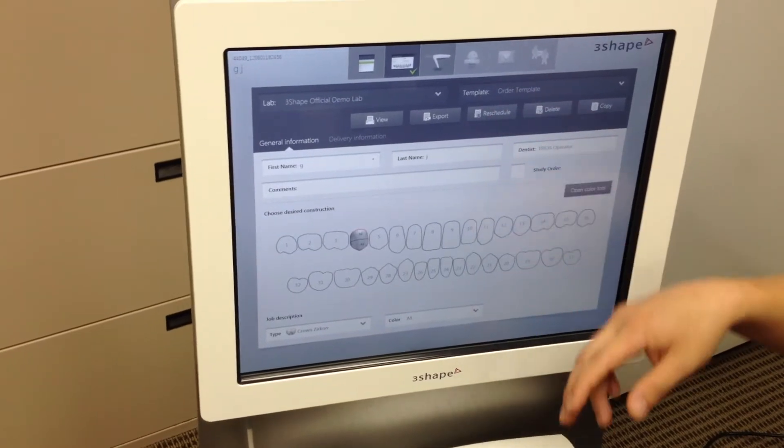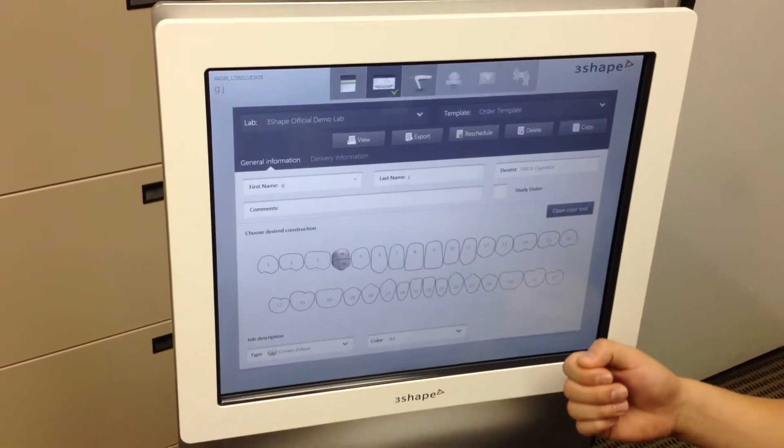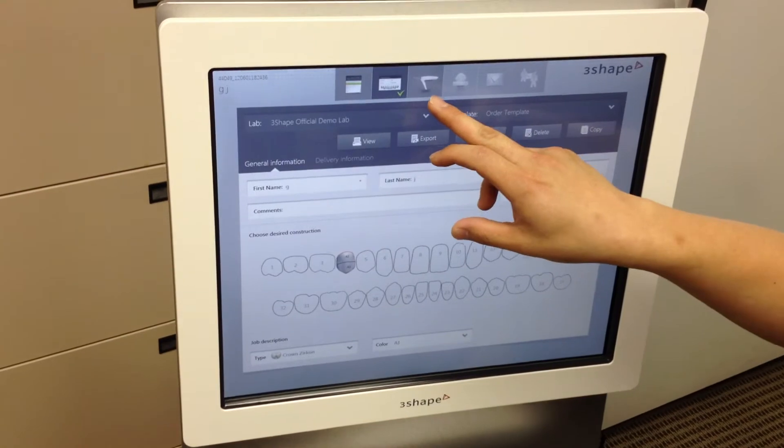After that, I can start my scanning process or I can just save the appointment. In this case, I'm just going to go ahead and scan it in.